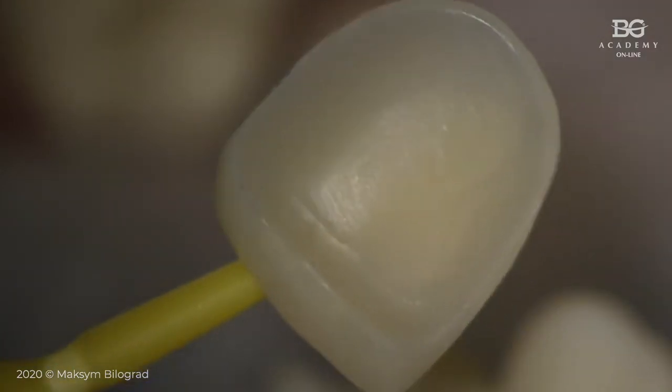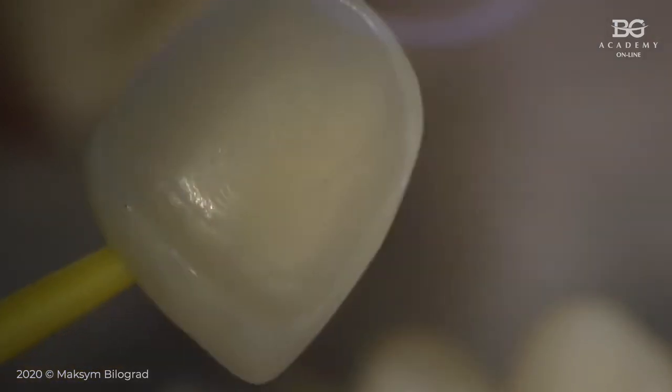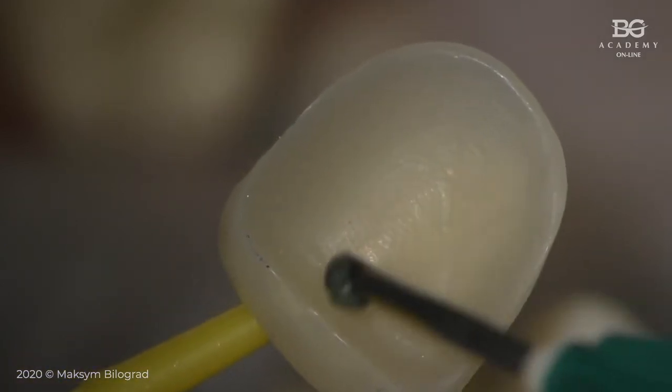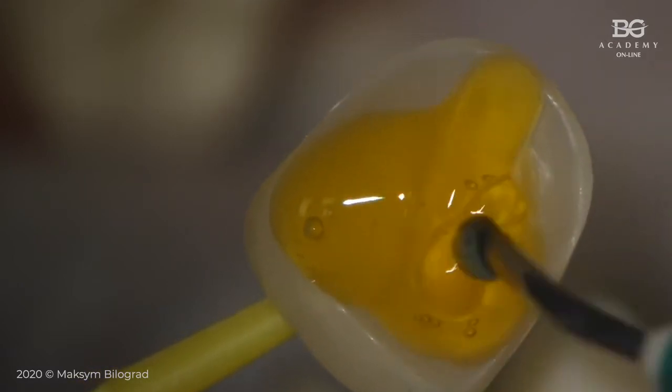Okay, so let me do etching with hydrofluoric acid one more time. I'm not doing this in my patient's face, as you may understand. It's just because of the phantom, and I have to rinse it out. We will do it outside somewhere. So I will put some hydrofluoric acid here. Okay, it's too much.